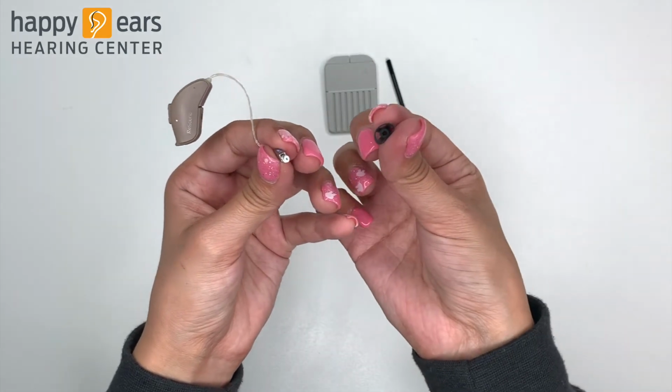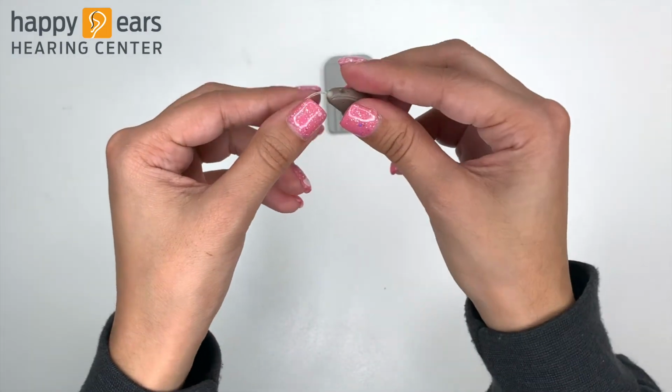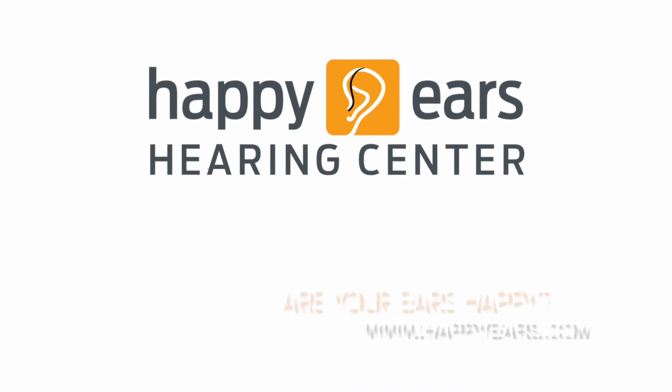Place the dome back on the tip of the receiver and make sure it's snug so that it doesn't fall off or get stuck in your ear. And that's all there is to it.